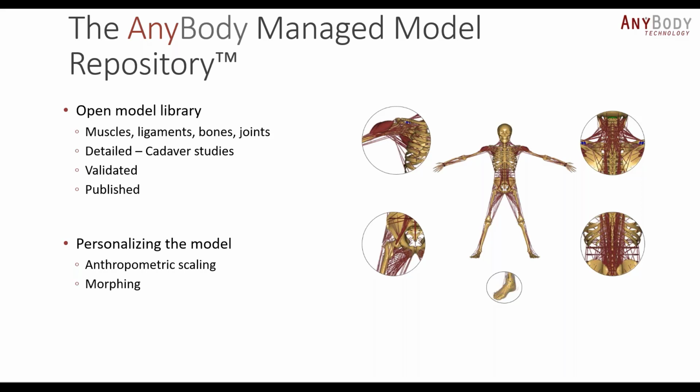And these models have been validated in several studies, and numerous works have been published using these body models. The model can, of course, be personalized using simple anthropometric scaling or really detailed subject-specific morphing using patient-specific image data.